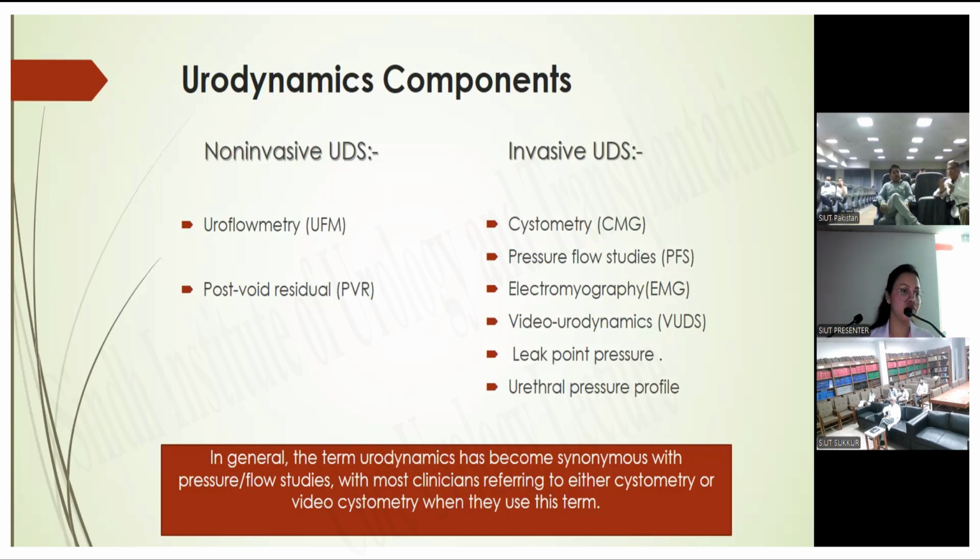And that should be correlated with the urodynamics: the patient's complaints, the doctor's question, and the patient's findings. So that will be rightly seen by a doctor, and he should be there. That will then be great for the patient and for this technology, which is very beneficial for these patients.